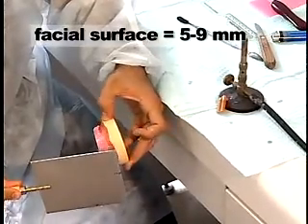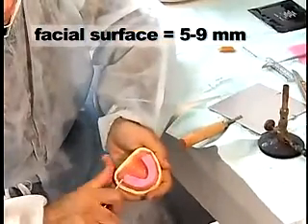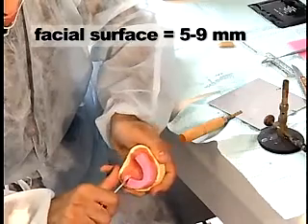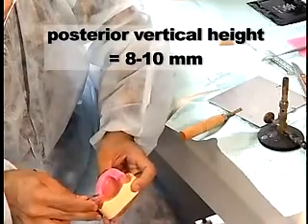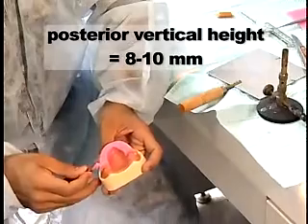The facial surface of the wax rim is approximately 5 to 9 mm anterior to the center of the depression of the incisive papilla. The posterior vertical height measuring from the basal seat surface of the tuberosity to the occlusal plane is 8 to 10 mm.